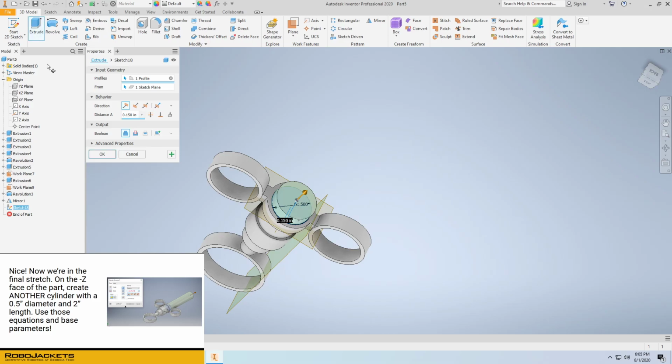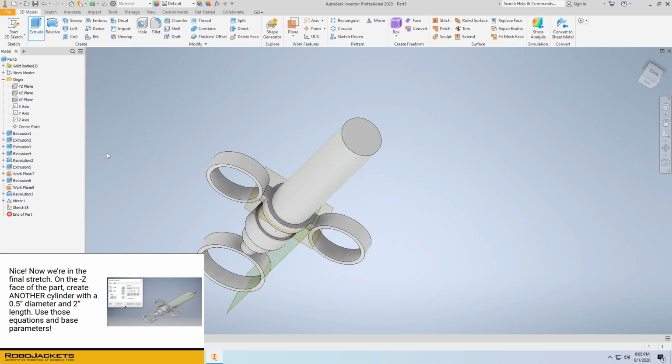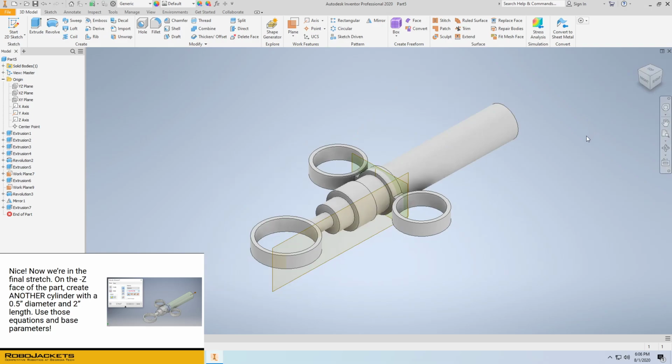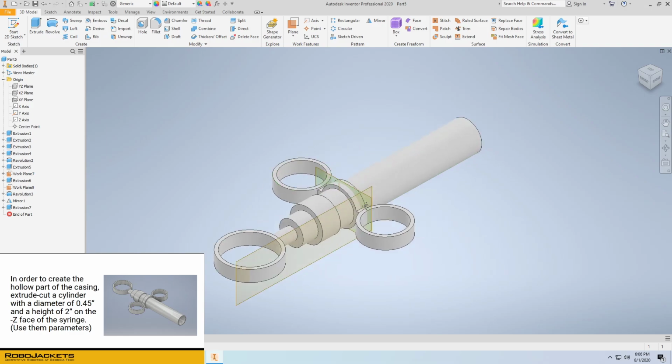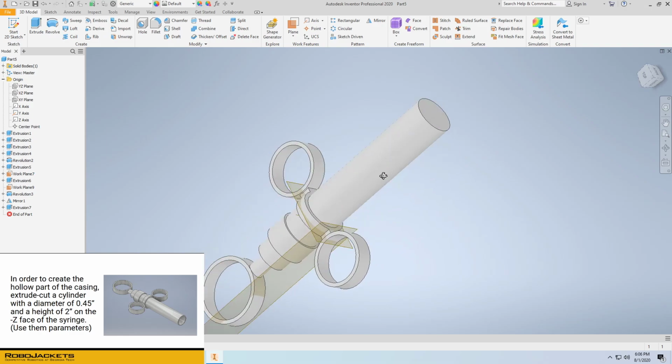2 inches. Now if you remember, our main thickness was 0.25, and so that's going to be an 8 times scale. There we go. And headed back to home view. We can see that it looks just about right. Now we're going to hollow out that new cylinder. So go ahead and move your view over here.